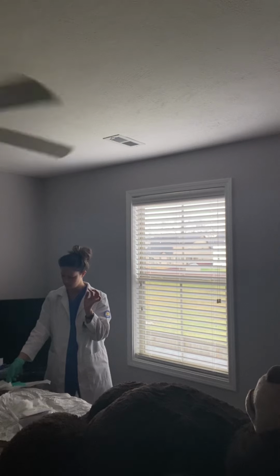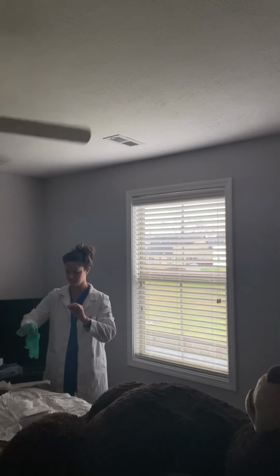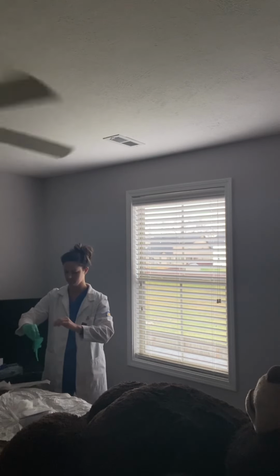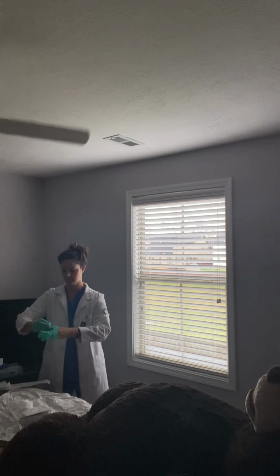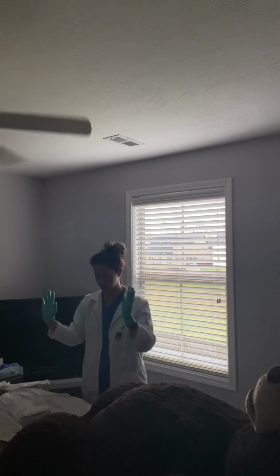Then you're going to take this one and grab the inside. And making sure you don't touch. So you've got it inside here. Pull it down. Okay, so now that I have my sterile gloves on, not going to touch that field anymore.